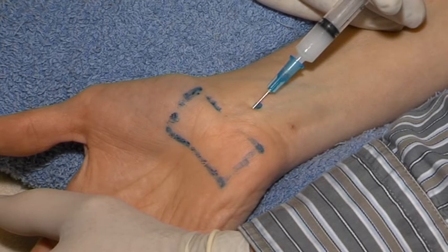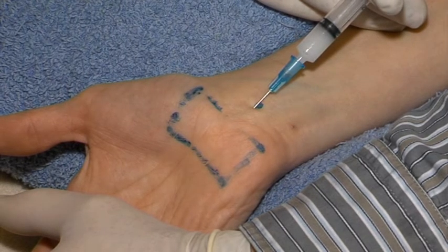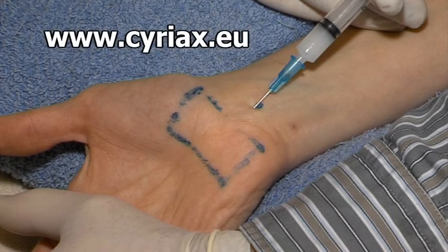Its entire length glides distally, under the transverse ligament, without piercing the median nerve nor the tendons. The injection is given slowly while withdrawing the needle. Normally, no resistance nor discomfort are felt during the injection. It is a diagnostic as well as therapeutic procedure.